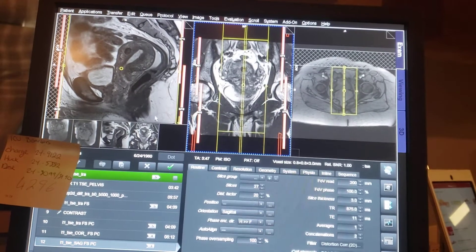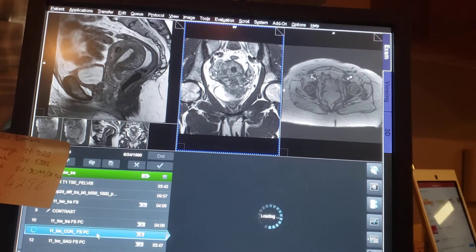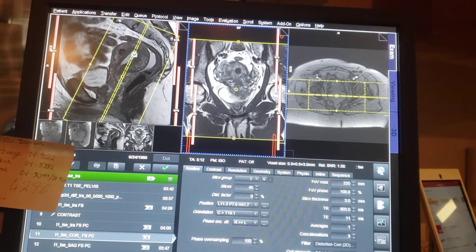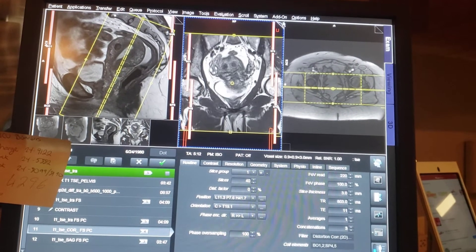My sagittal is pretty much a regular sagittal. And then my coronal, I angle like this with the plane there, inside of it. So when I angle like that, I come up with this picture here.